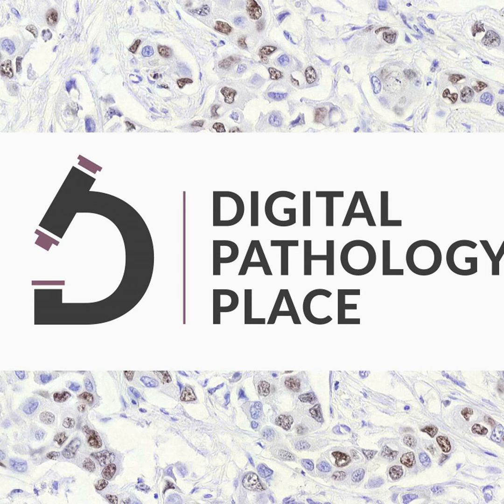Sure. I think every field comes up with multiplex, and basically it's a term that is used to describe how you can make multiple measurements at the same time. And in histology, really, we're thinking about the ability to look at multiple biomarkers on the same piece of tissue at the same time. We're also starting to see the incorporation of genetic markers in these multiplex assays as well.